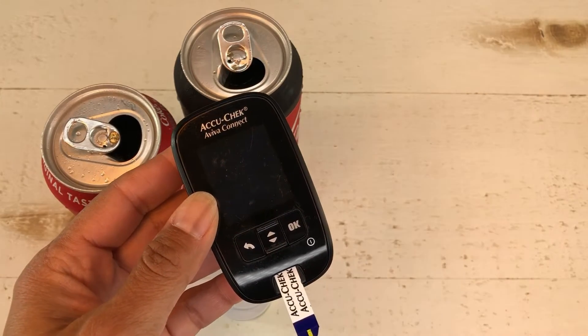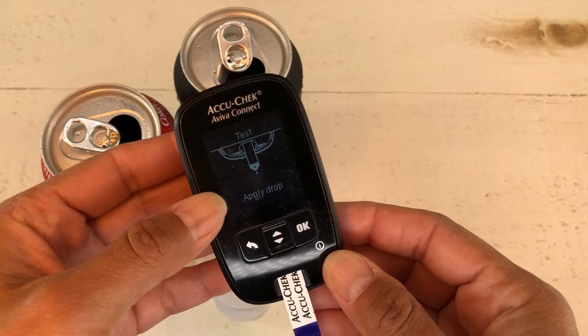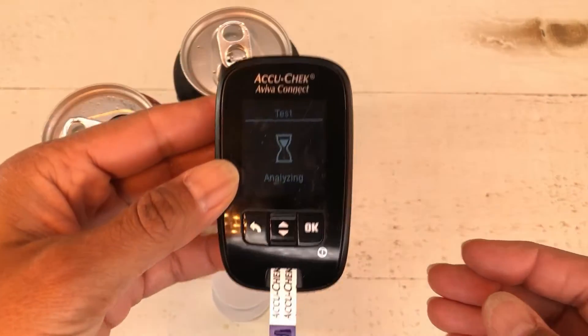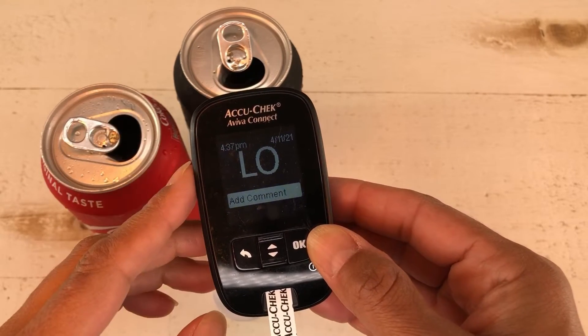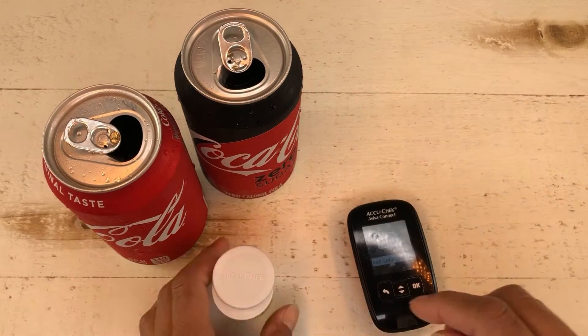I pop in my test strip and it says 'preparing to test.' It says 'apply blood drop,' so I just put it in the liquid. It says 'analyzing' - and there you go: LO, for low. That means that is a sugar-free drink. We kind of knew that, so let's do another test.